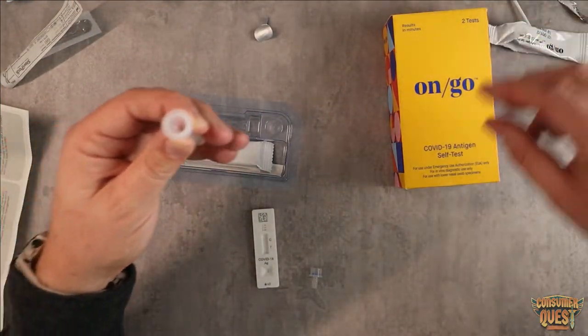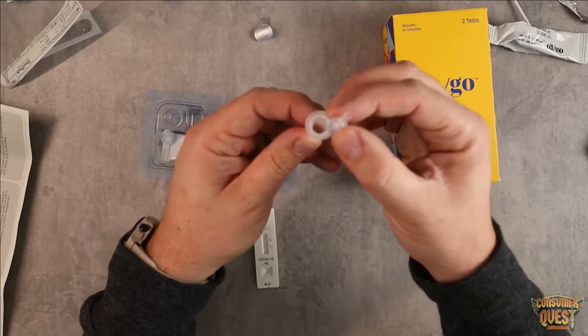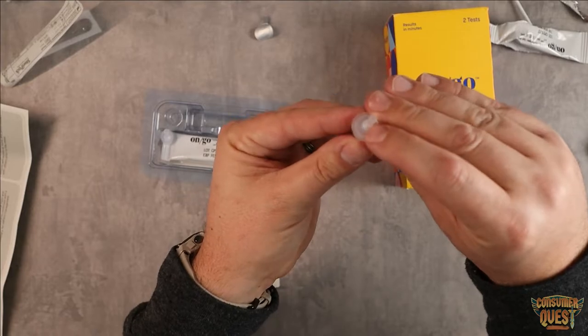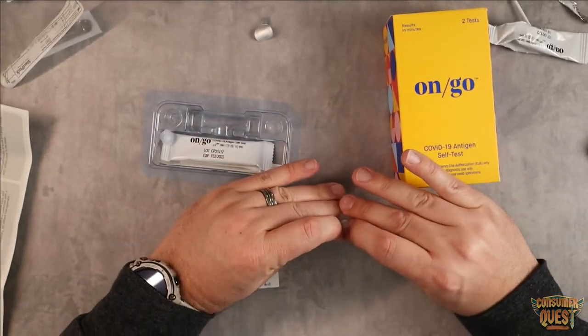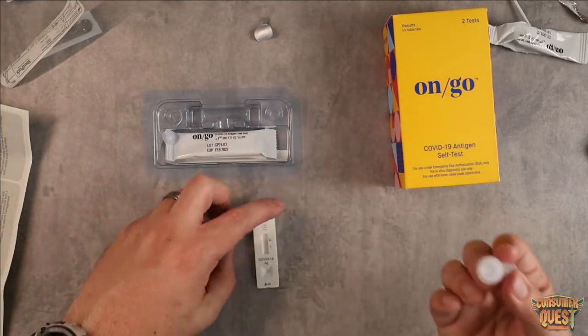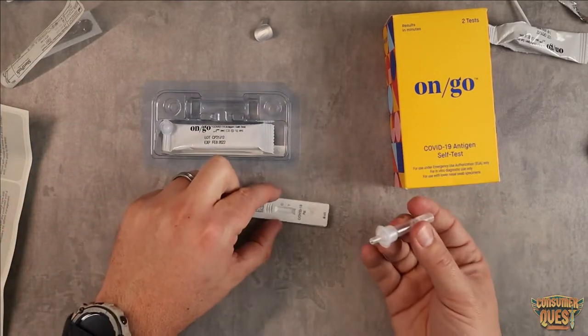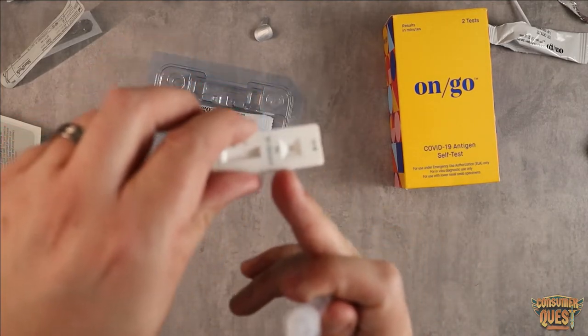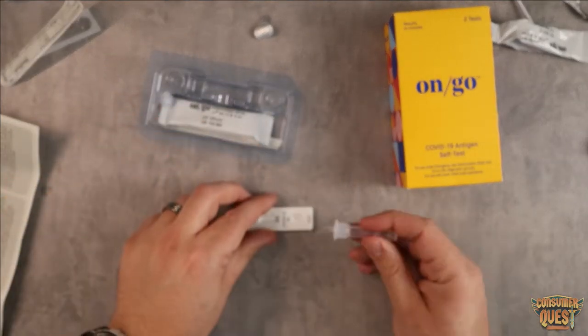We can discard the swab. Then we're going to take the cap and push it down inside this little area — push it all the way down as flat as we can so it's nice and contained. Now what we have is basically an eyedropper. We're going to take this and put three drops right down into this little hole where it shows the drop indicators.